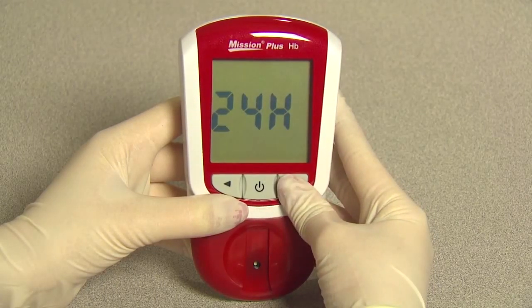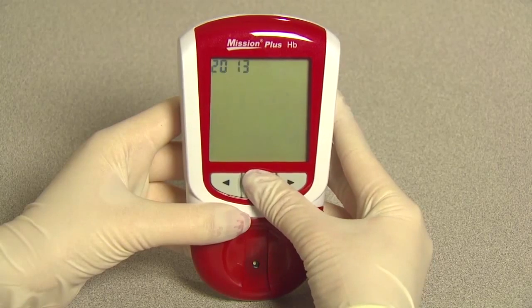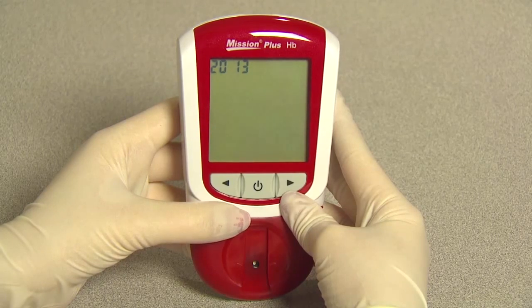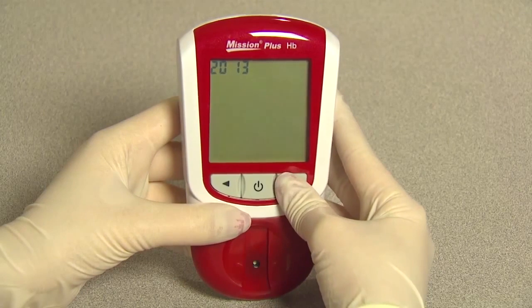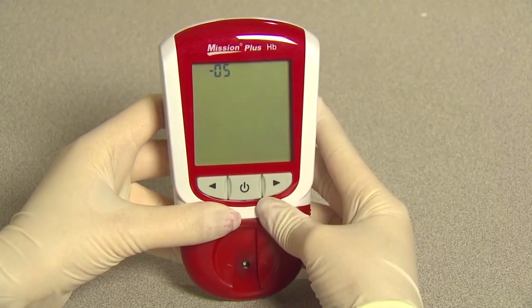The first option sets the clock to either 12 or 24-hour mode. Press right or left to switch between the two settings. Press the power button to save and advance to year setup. The year will appear at the top of the display. Press right or left until the correct year is displayed. Press the power button to save and enter month and date setup.